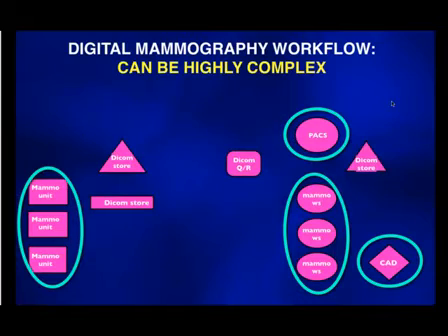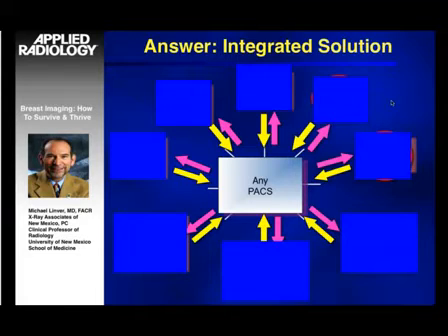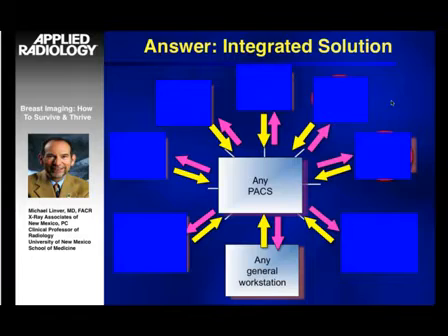And lastly, we've got other tie-ins, such as CAD, which all have to be tied in with the workstation and with the mammo unit. So the system, the way this works, has to be done quickly and smoothly through a well-integrated PACS system, so that all of these systems communicate instantly and immediately. And you can see here, this is rather complex, but can be simplified by the use of a good PACS system. Let me get the next slide here, just to show you. This is a typical PACS system, and all of these little boxes contain issues that a good PACS system must be able to contend with, not only to get information from, but extend information to.